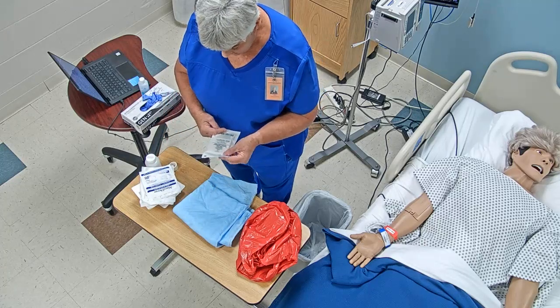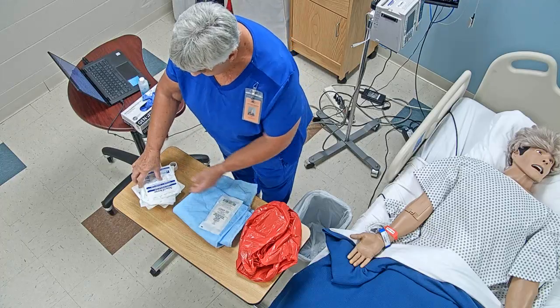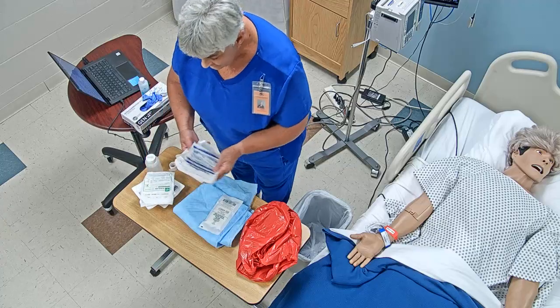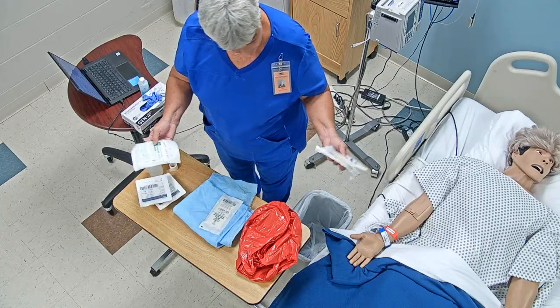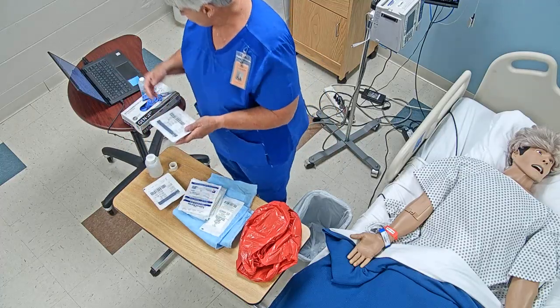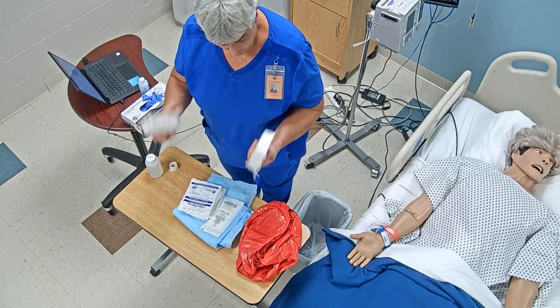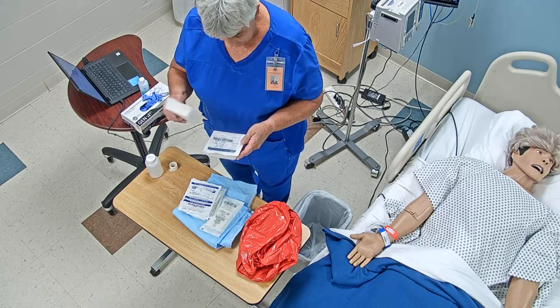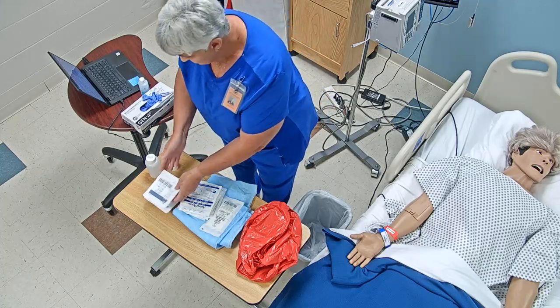On these, I'm checking for expiration date. I'm checking to make sure they're all intact. I've got enough sterile gloves to make sure I can keep the procedure sterile, because the policy says to do, and the order said to do, a sterile dry dressing. So I'm going to need to know how many 4x4s I need. And then if I have any extras, the expiration dates on these, and are they intact.